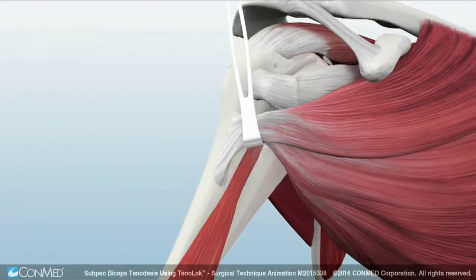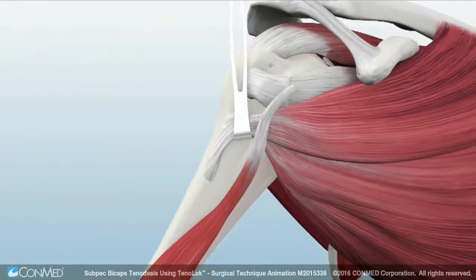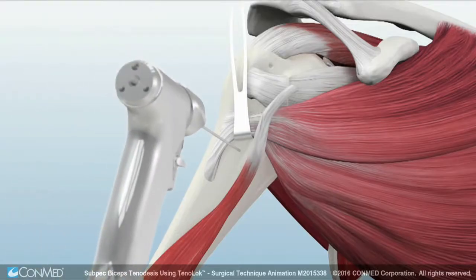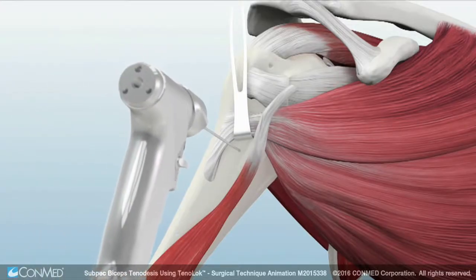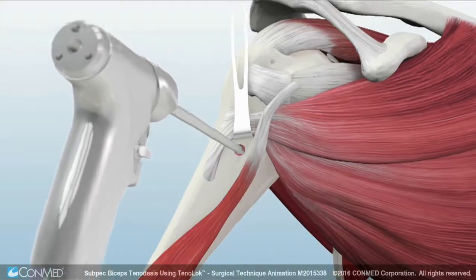With proximal retraction of the pec major, the long head of the biceps tendon will be located just medial to the pec major insertion. Next, place a drill tip guide pin centered within the bicipital groove, 20 mm from the inferior border of the pec major tendon insertion.